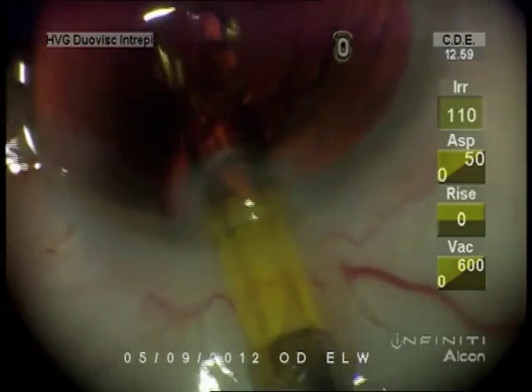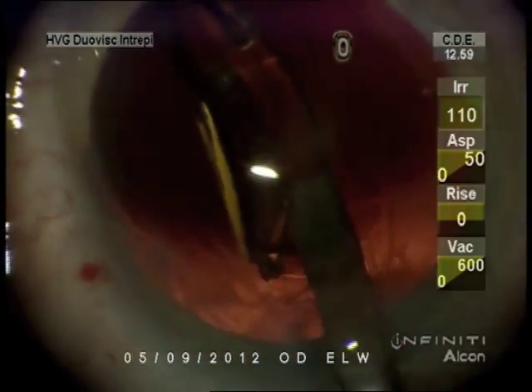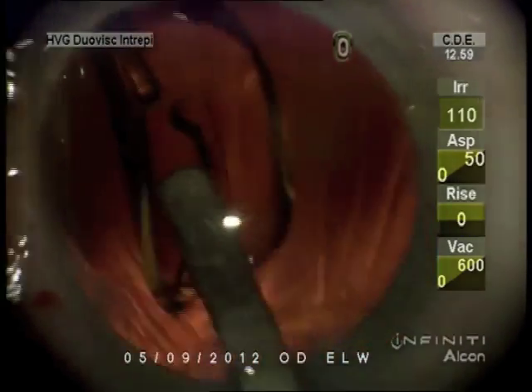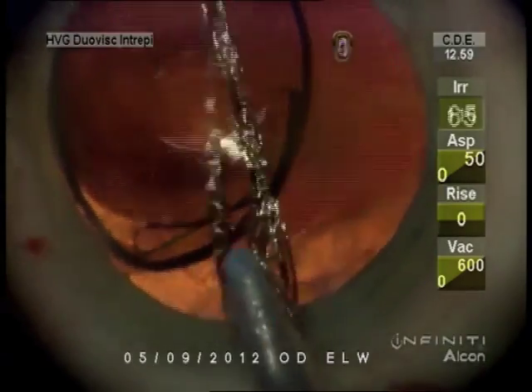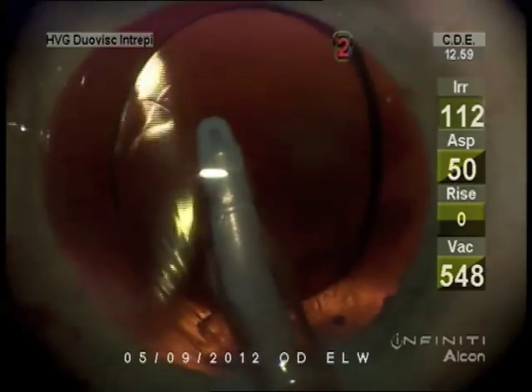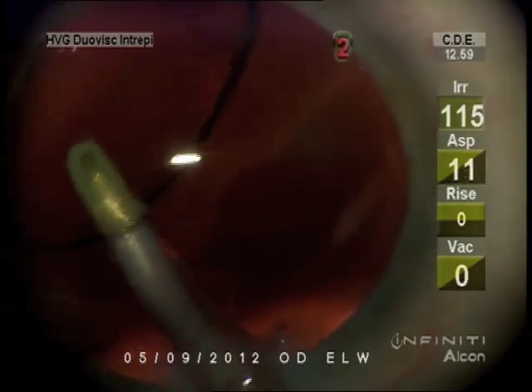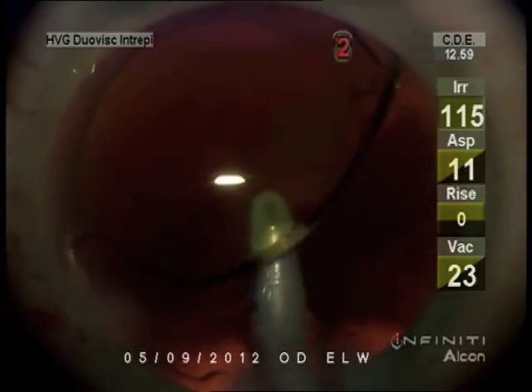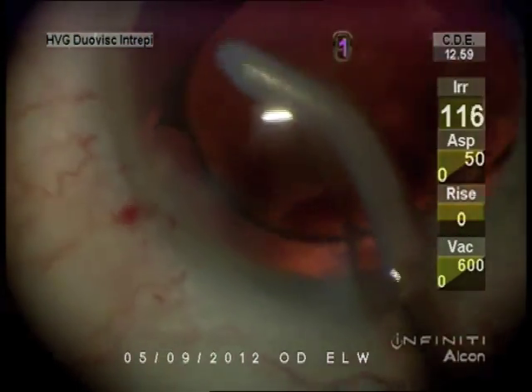Just to be sure that if the patient moves, we're not poking the posterior capsule. And just turn out this probe to position the lens. And I use the highest vacuum here because the cohesive viscoelastics are the most cohesive under high shear vacuum, so it helps to pull it all out even from under the lens, but I still go under the lens just to be sure.